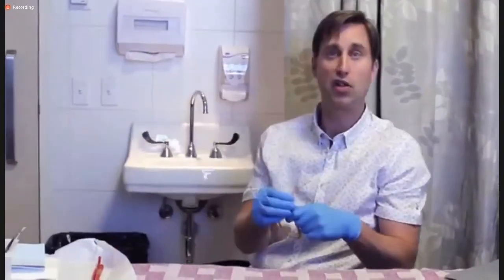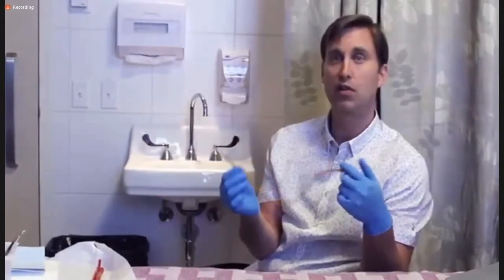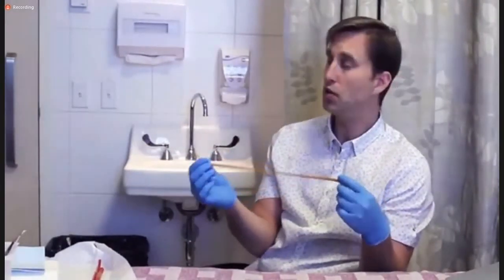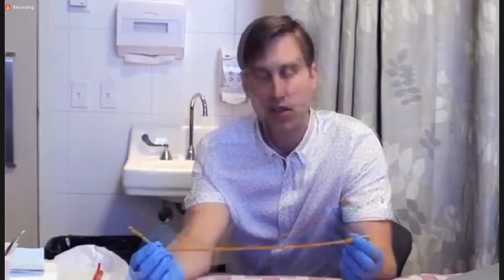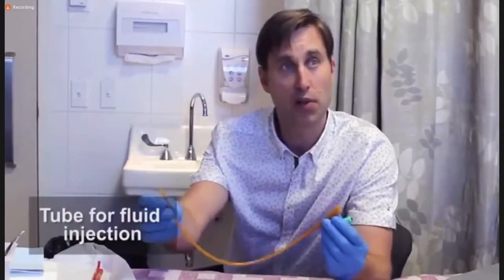So what is a urinary catheter, you may ask yourself? Quite simply, a urinary catheter is either a latex, polyethylene, or silicone tube that one places inside the urinary tract to drain urine from the bladder. Generally speaking, it's made up of a couple of parts. It's a tube. Most of them have two ports. One is a tube that you use to drain urine through. The second usually has a port through which you inject fluid that will keep the catheter in place.